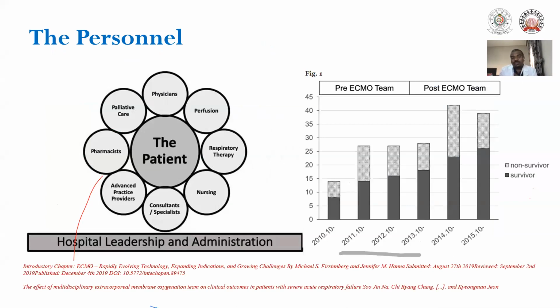A better clinical outcome can be achieved in patients treated with ECMO with a well coordinated and multidisciplinary team specialized in ECMO, which can consist of physicians, nurses, perfusionists, RTs, anesthesia technicians, physician assistants, a lot of team involvement, to smoothly handle this situation. They all should understand the pathophysiology and the mechanism of ECMO. We as RTs are capable of doing this. In a typical practical aspect, the clinical setting of such a team effort will prevent technical errors and provide a better treatment strategy. This will also help us to document and record these strategies for further clinical research and for reporting as well.